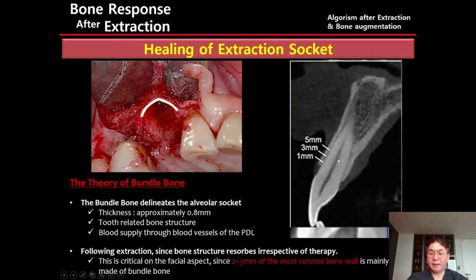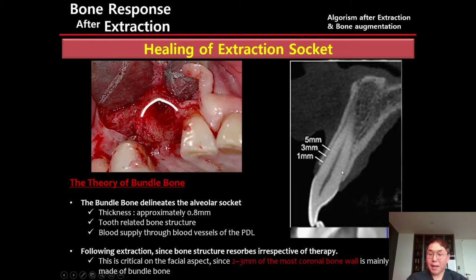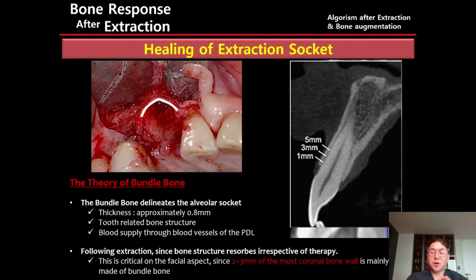Let's look at the CBCT of an anterior extraction socket. In the labial side, the coronal portion of labial bone is quite thin. On the palatal side, however, the outer cortical bone is quite thick. So even though the inner bundle bone will be gone, the outer palatal cortical bone can maintain the vertical bone level. Only the labial bone will be gone — we should remember this.